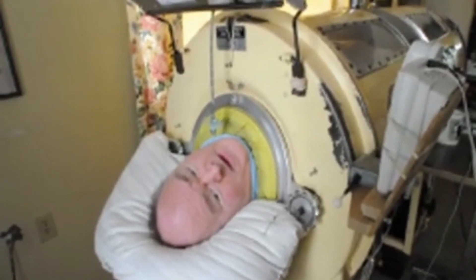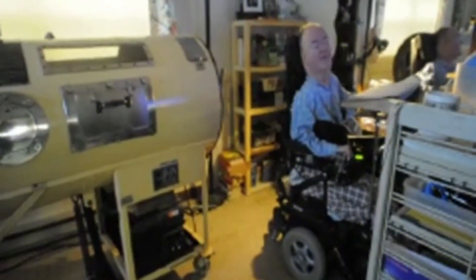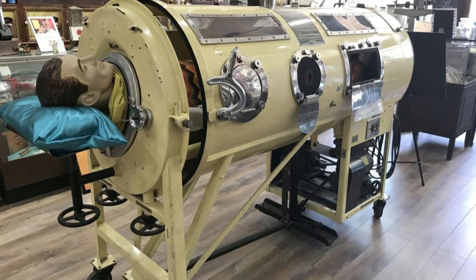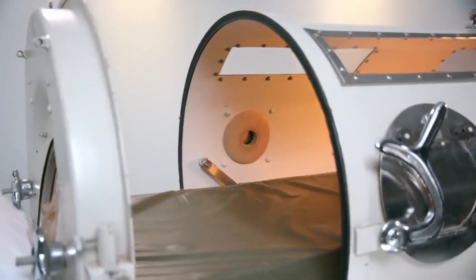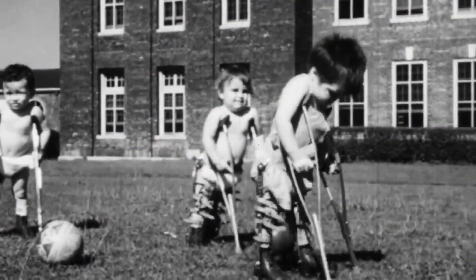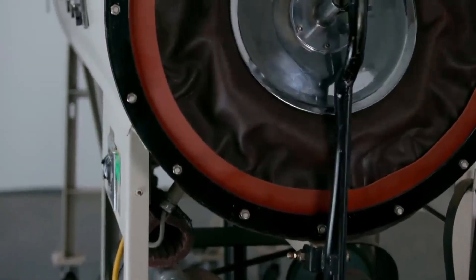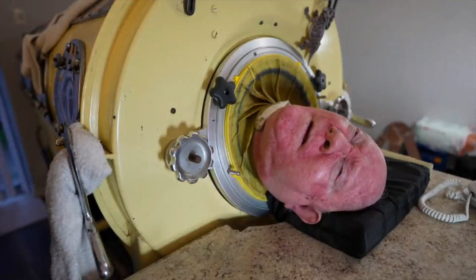Iron lungs were able to keep patients alive for weeks, months, or even years, giving them a chance to recover from the disease. They also paved the way for other respiratory treatments such as positive pressure ventilators, which are still used today. The history of iron lungs is a testament to human ingenuity and the power of medical innovation. Despite the challenges posed by polio, doctors and scientists were able to develop a device that saved countless lives and helped usher in a new era of respiratory treatment.